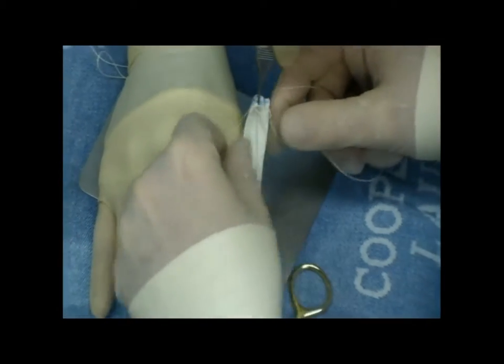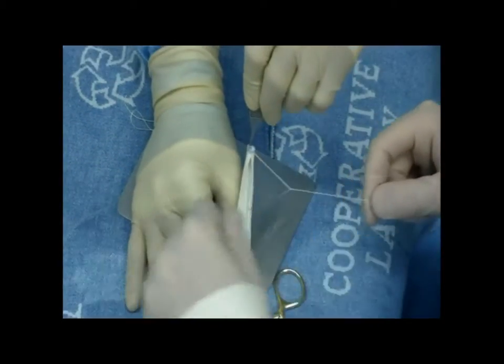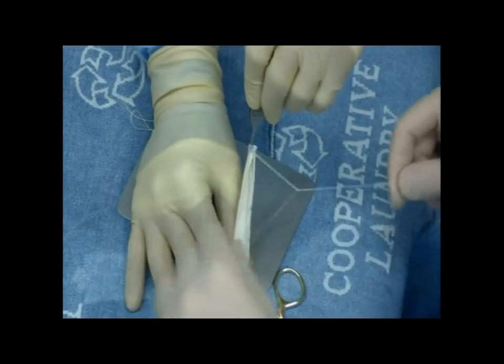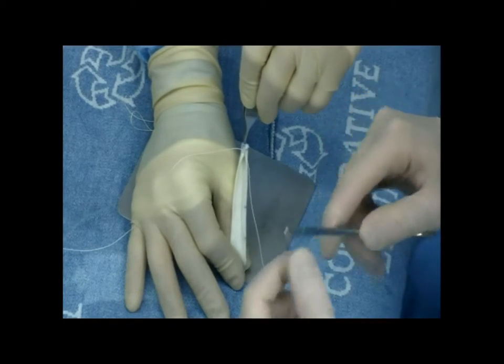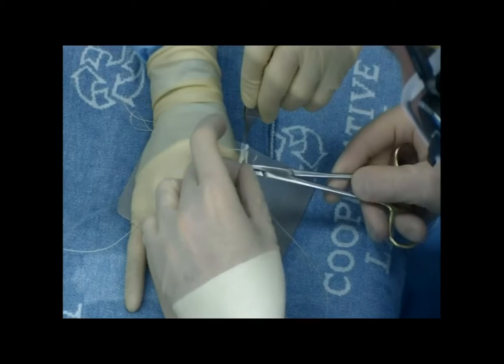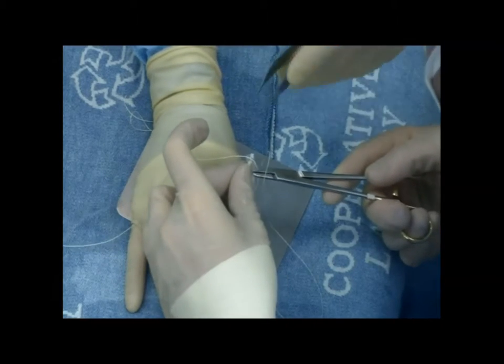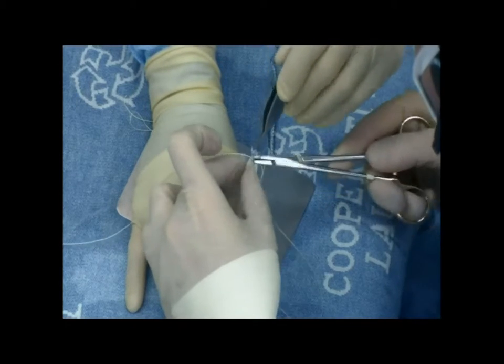These two sutures then functionally become the holding sutures so that you can put it on the graft master. Once the knot is tied, you then pass it through the invagination in the end of the graft to get the suture on the other side. That just makes for a nice uniform tensioning stitch when you place it in the graft master. It also buries the knot, so aesthetically it makes the graft look nice as well.